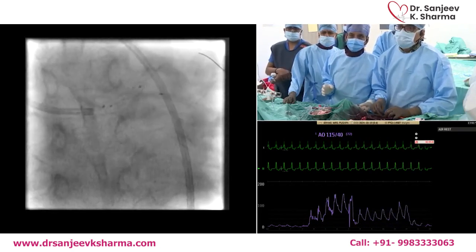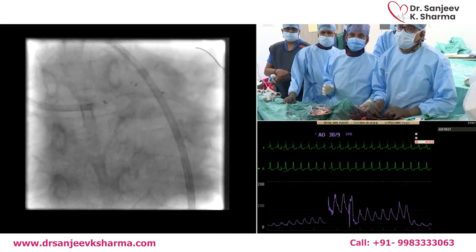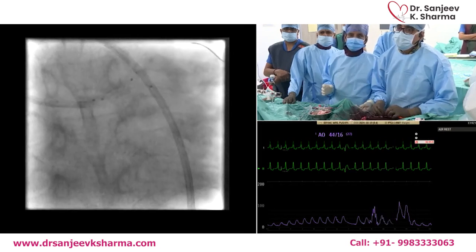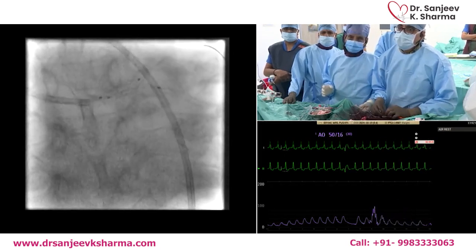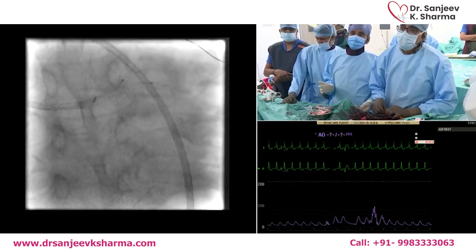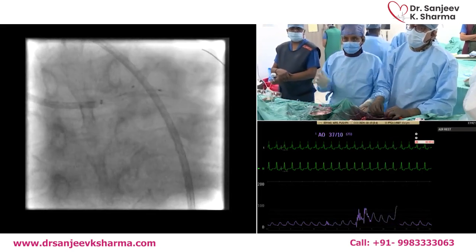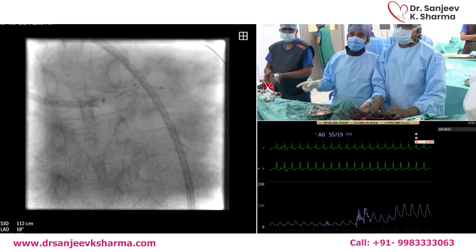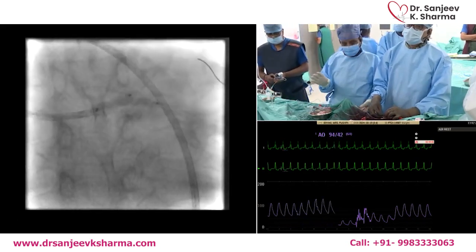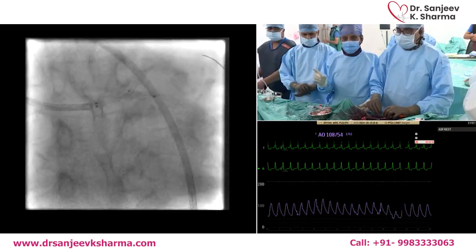I'm also noticing that you're not using any kind of support. In the US, in a case like this, usually people look for some support with so much complex work in the left main and bifurcation. Would you do this with Impella or not? This case is a little different because the LV is completely normal. If the RCA is open like in this particular case, I think you can get away with just a balloon pump, but definitely not the Impella. But if the RCA is totally occluded, even with a normal ejection fraction, then it's the ideal case for the Impella.